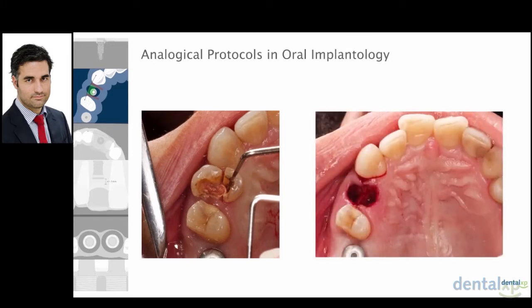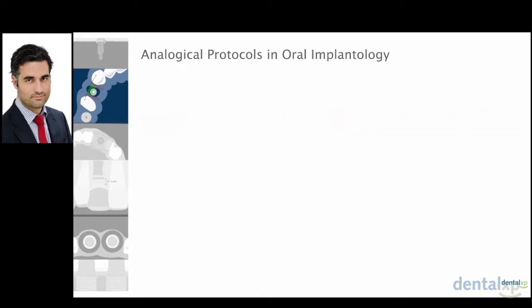Of course, we speak with the patient, and we tell her that to replace this tooth, we can immediately replace the root with an implant. And if the surgery goes okay, and if we can get enough primary stability, we can try to do an immediate loading or immediate restoration. So that's what we proposed to the patient.